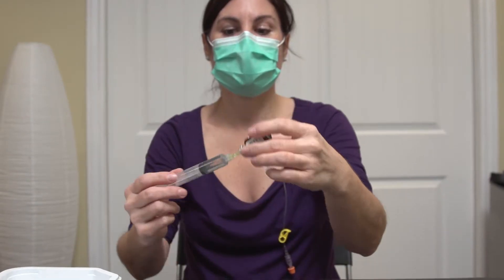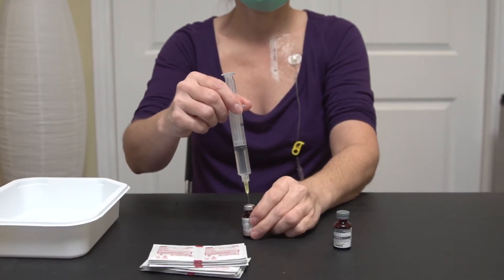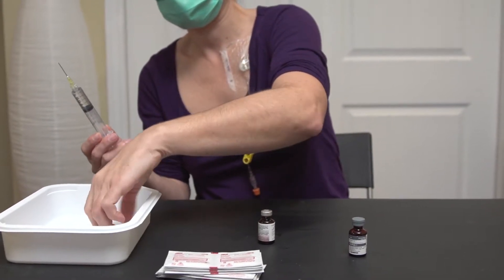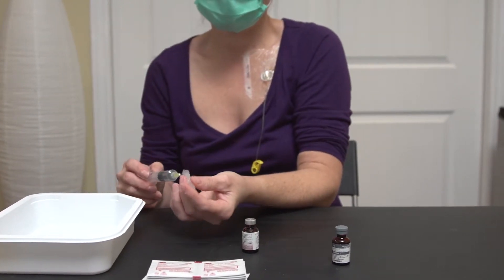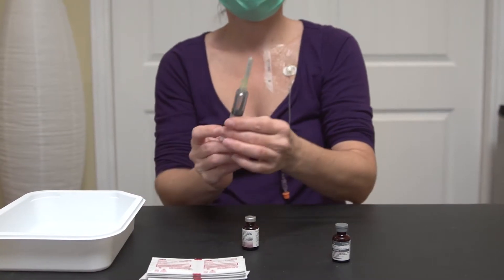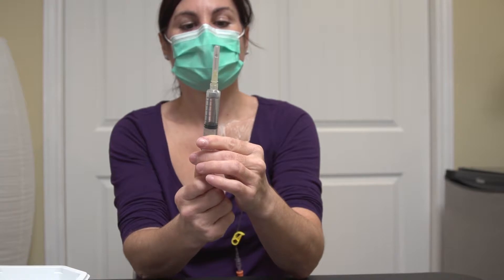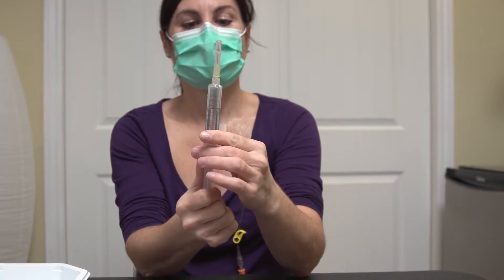Pull the vial down. Remove the needle from the vial and put the cap back on the needle. Draw 5 milliliters of air into the same syringe, cap the needle, and put it in the tray.